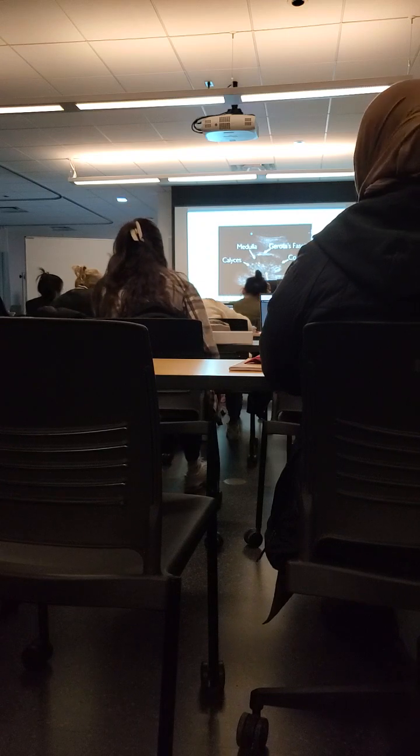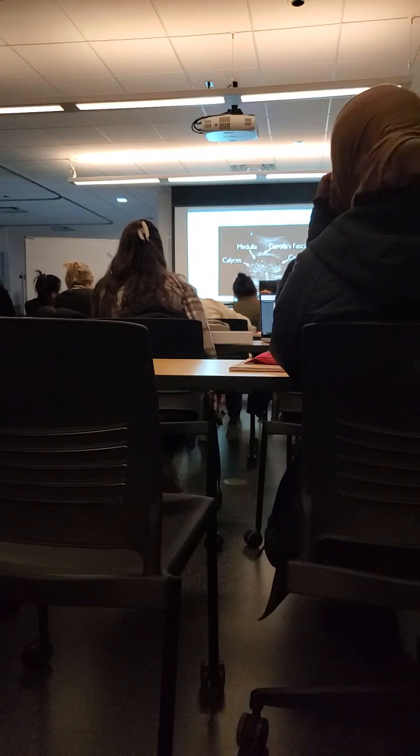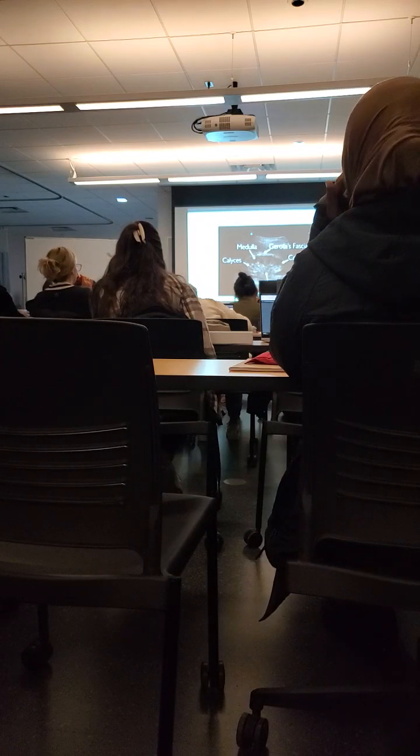Toni? Yeah. It's really hard for me to distinguish if I would be including the medulla in my measurement. If you're trying to measure the cortex for the 1 centimeter, it looks really hard to distinguish where you would stop and where the medulla starts. Honestly, everybody measures it a little bit differently, but all I've ever really seen is they measure it from here to here. Oh, they do go into the medulla? Okay. Just don't do it where a pyramid is, because that wouldn't be accurate, since they're really looking at the tissue. But yes, you would actually cover the cortex and the medulla. That's how I've seen it.